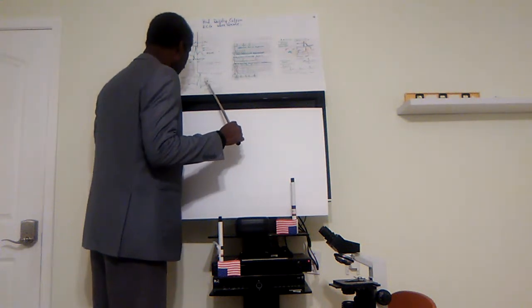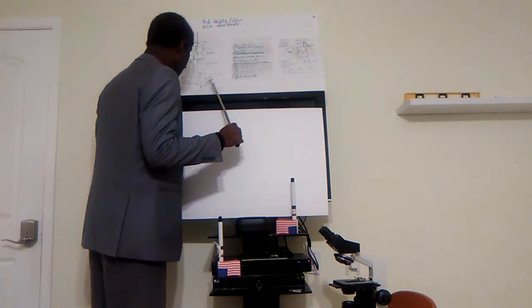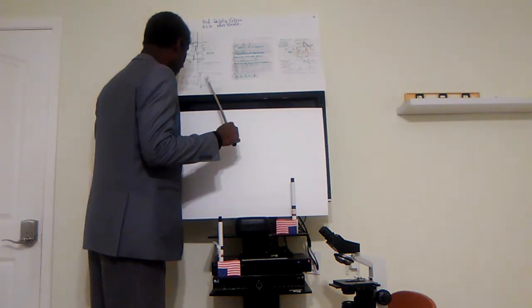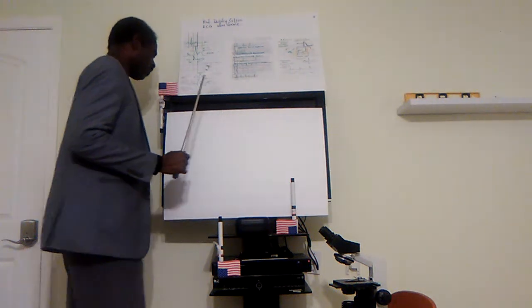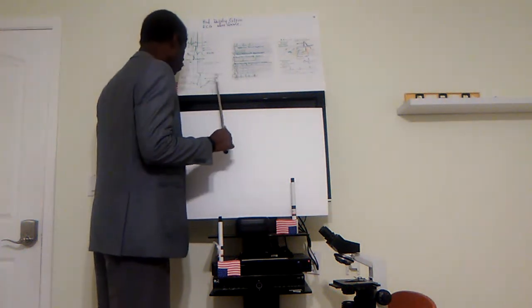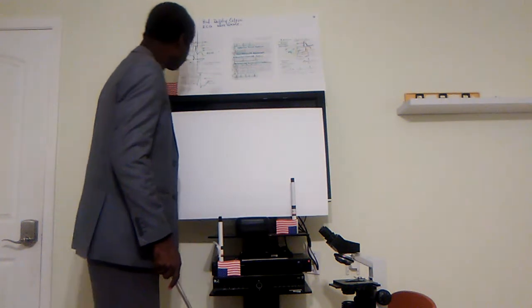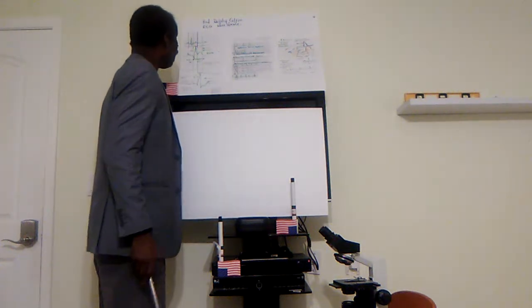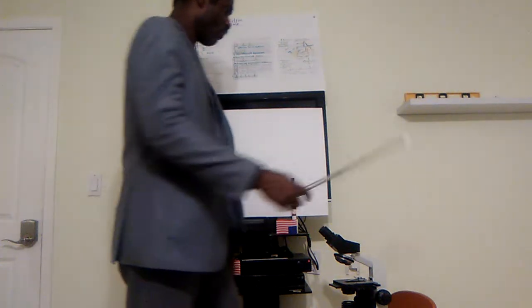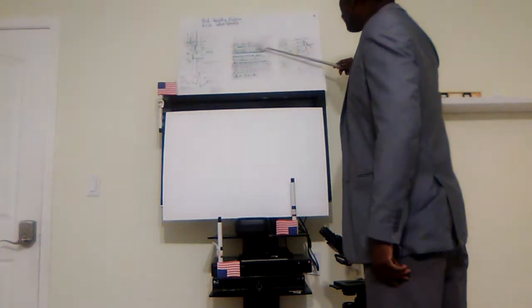And here, what we have is the T wave, which is a relaxation of the ventricle, and the U wave, which is generated from the Purkinje fibers, said to represent the repolarization of the Purkinje fibers.